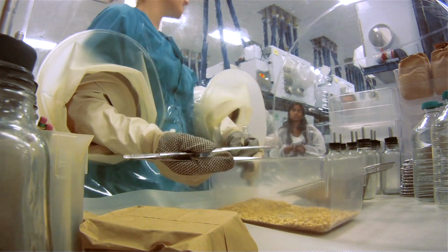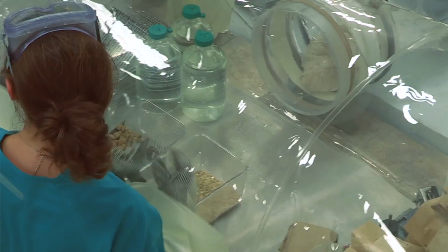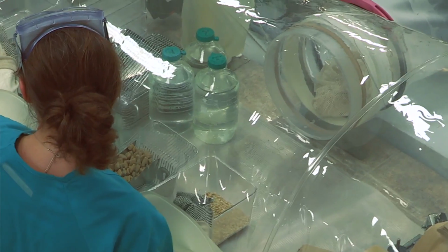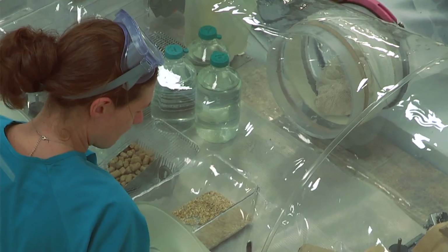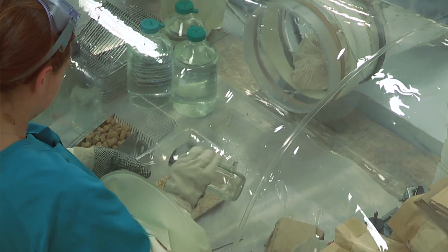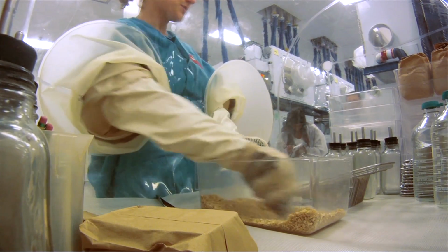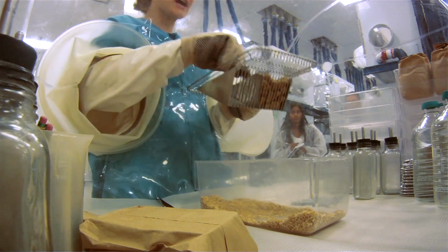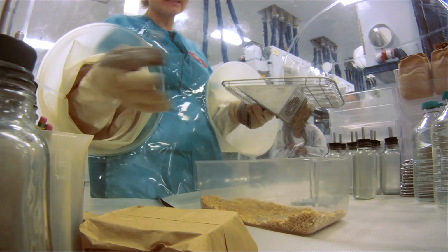Now, often when you're in a dirty cage, it's hard to tell what's fresh and what's been there for a while. So lots of times, if we're using another cage to hold the animals while we're cleaning that cage, I'll just select my fecal pellets from there, so that way we know that they're fresh. I'll moisten swabs. And from in the cage, swab the floors, swab the cage top, the feed, the water bottle goes in, the animals before they go back into the cage.